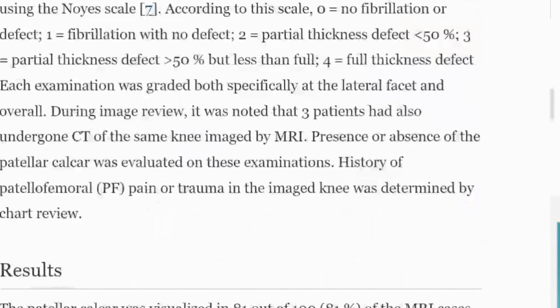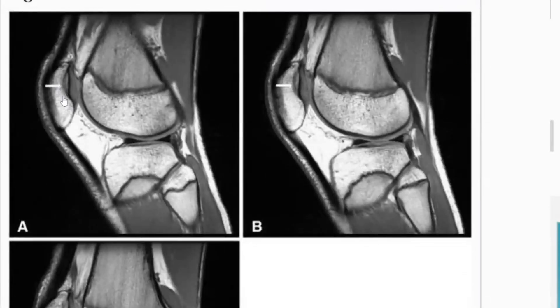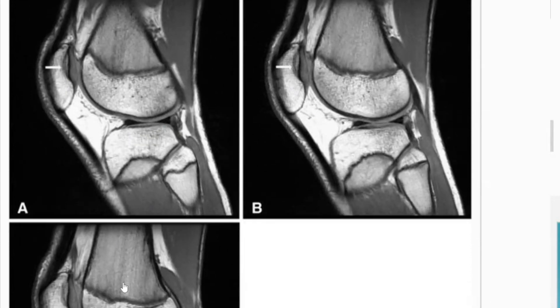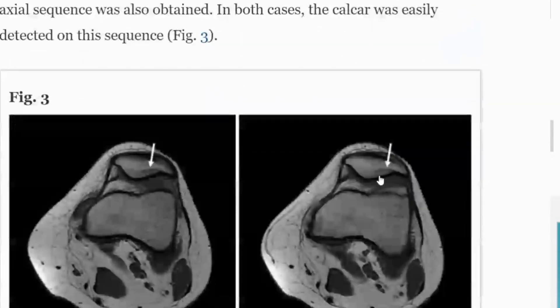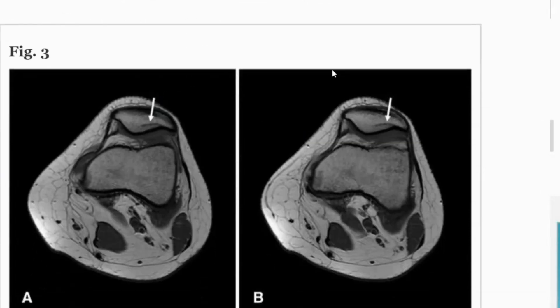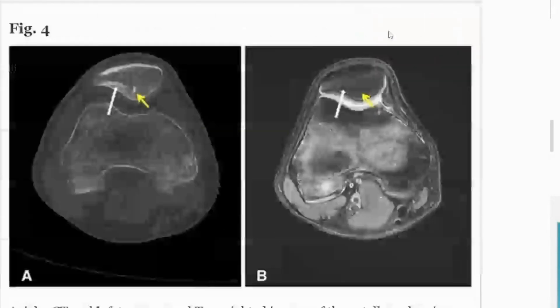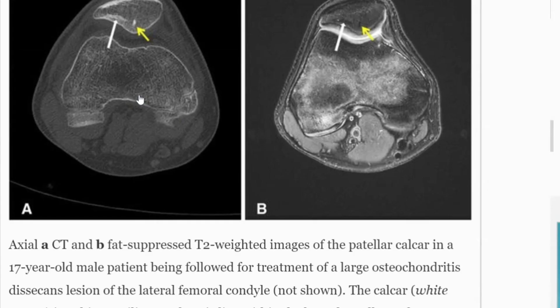Let's go to the images. This is a typical appearance of the calcar — you can see we are on the lateral aspect of the knee on a couple of consecutive slices, and on axials exactly the same, you're on the lateral side. This is the patellar calcar here. This is not a stress fracture, this is not osteochondritis dissecans. This is just a normal finding. Even on CT you can see it.